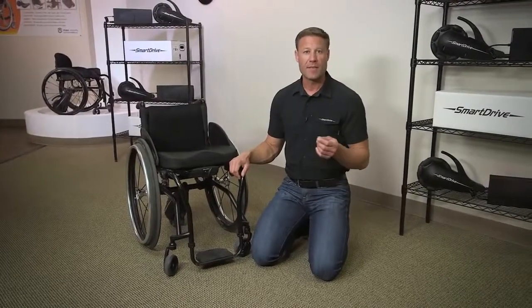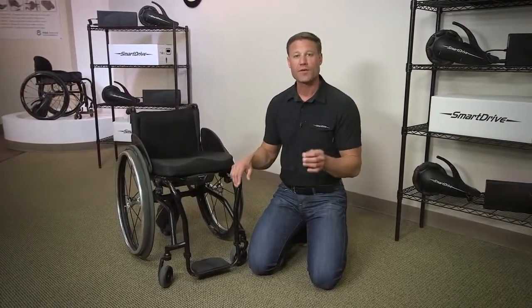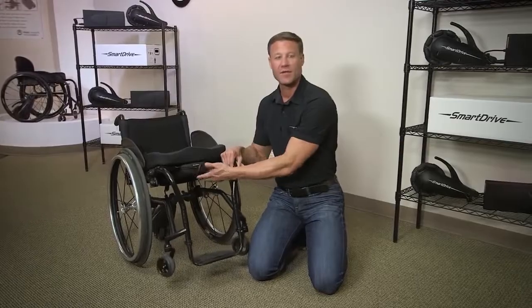While the SmartDrive can be mounted to almost any wheelchair, including folding frame chairs, the preferred wheelchair is a rigid frame chair with enough space under the seat to comfortably fit the battery. If you don't have this type of chair, you might consider getting one as your next chair, since it will help you get the most out of your SmartDrive.